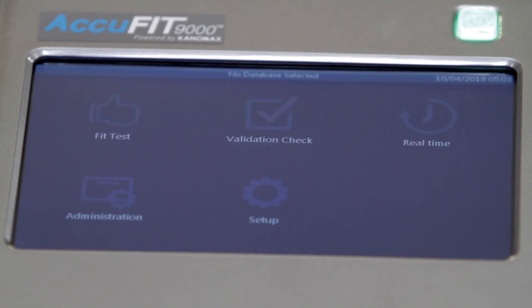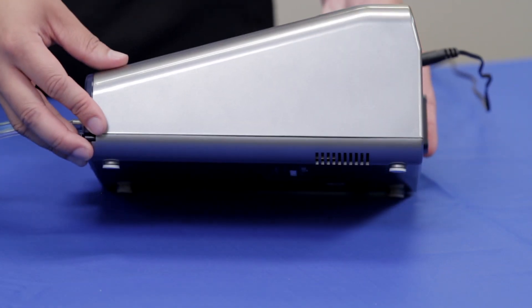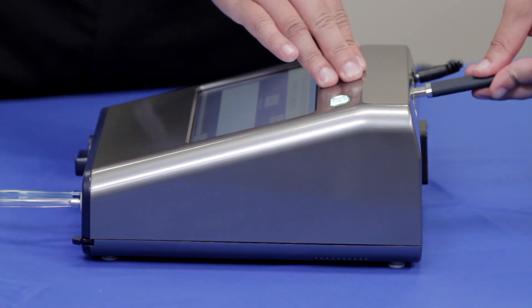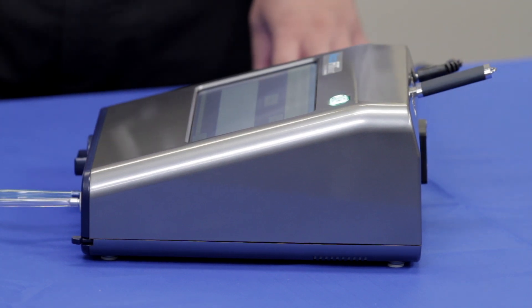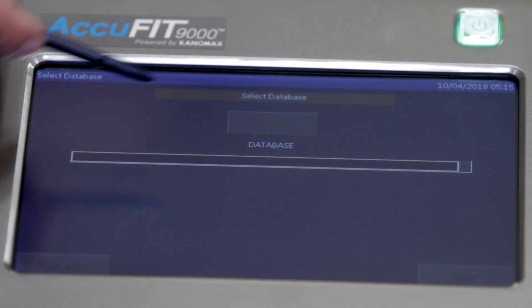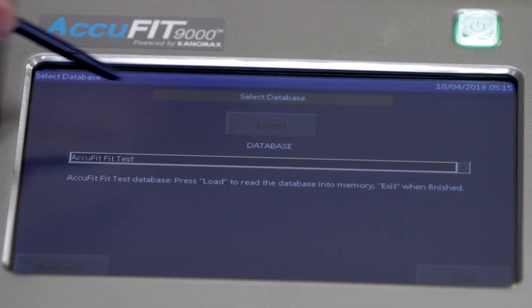To begin testing, turn on the device to display the main activity screen. A validation check will need to be performed to confirm that the AccuFit is operating properly and the environment is suitable for fit testing. Be sure that the device is operated on a level surface. If using in standalone mode, insert the USB flash drive that has been configured with the required database information. Select Validation Check, select the desired database from the drop-down menu, and tap Load.